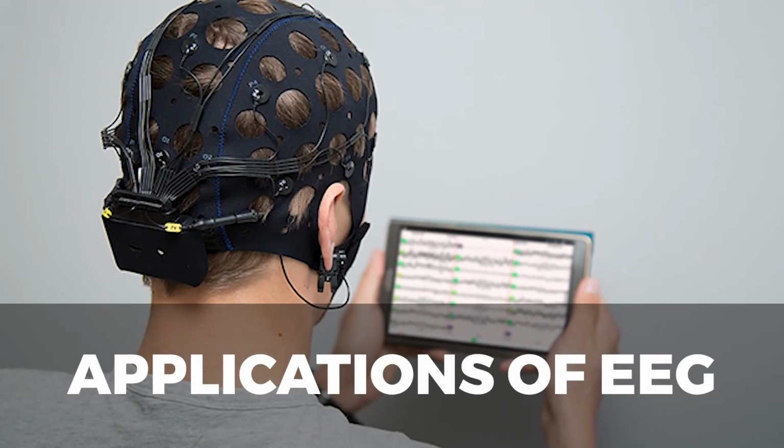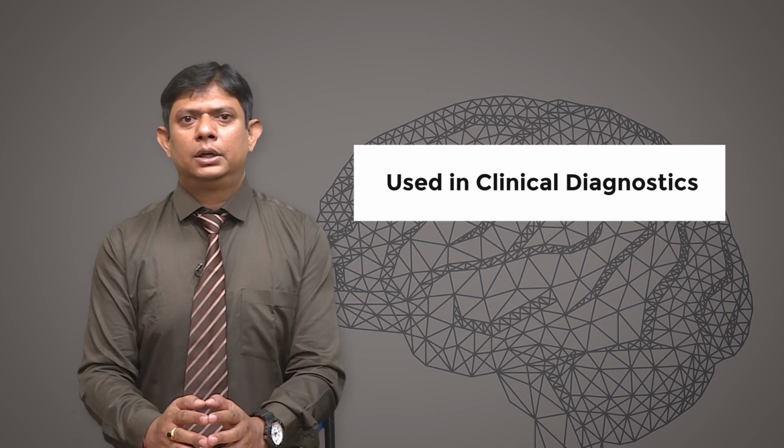Now, let us discuss the various applications of EEG. Certainly, EEG has a wide range of applications in the biomedical field. Here are some of the key applications. In clinical diagnostics, EEG is a primary tool for diagnosing and monitoring epilepsy. EEG is also essential for diagnosing various sleep disorders. It tracks sleep stages, breathing patterns and disruptions in the sleep cycle.